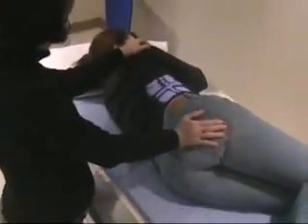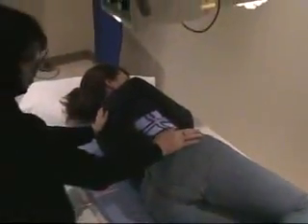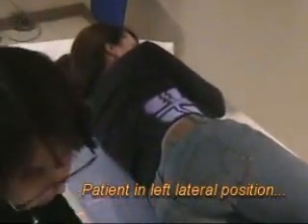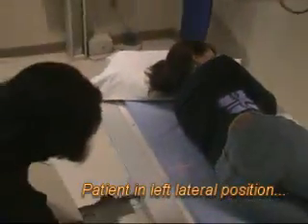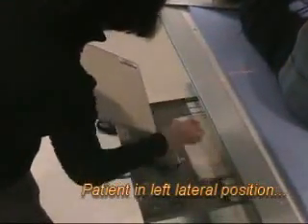Wendy is a very good patient, so her spine always lines up. You're probably not going to get too many of those patients in the clinic — you're not going to line up so perfectly.